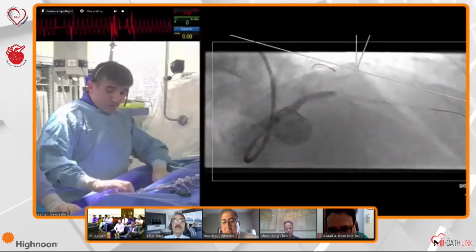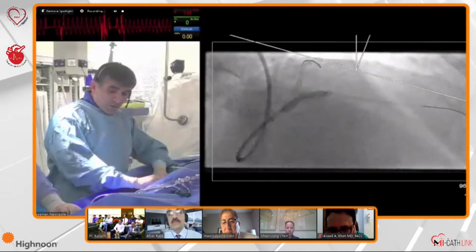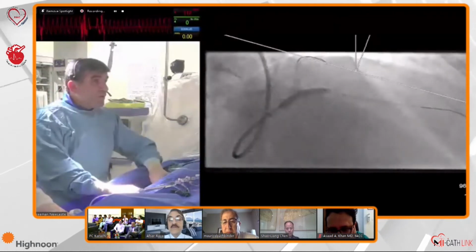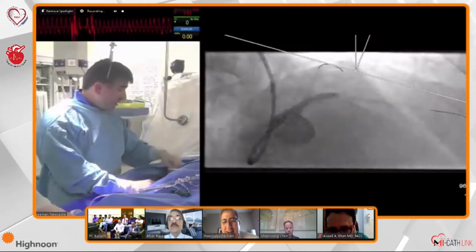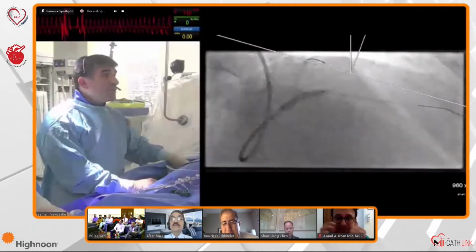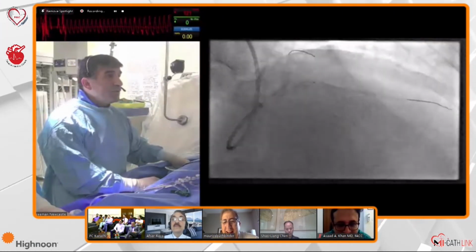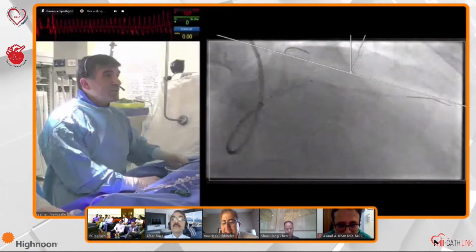It's not a problem. Obviously, there has been all this noise about using the Synergy and about causing longitudinal deformation. I think it is operator related, if I'm honest, because I've seen it with every single stent. If you don't look after your stent, it is going to get deformed.